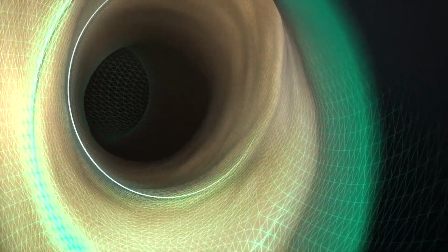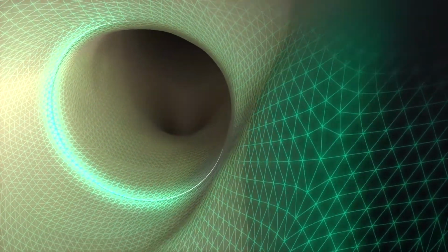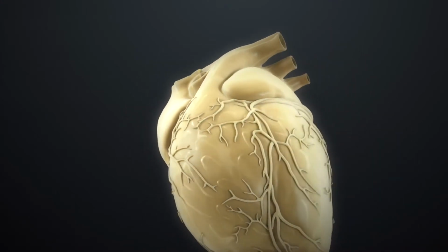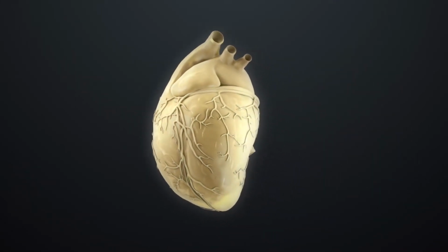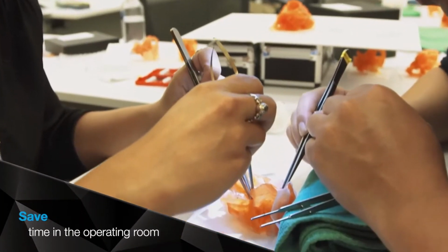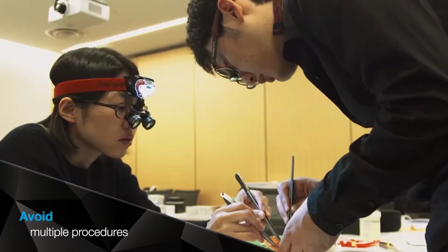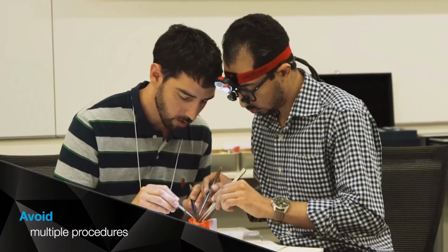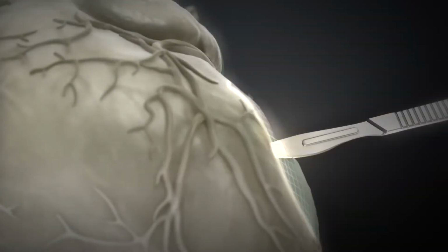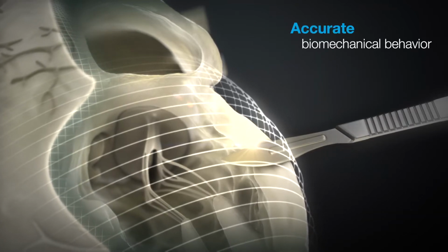3D printing technology, software, and materials combine to create models that replicate close to the same biomechanical properties as human tissue and bone, giving you the power to create the most lifelike anatomical models available. Academic medical centers, hospitals, and medical device companies can create realistic testing environments and train in settings that are as close as you can get to the real thing. Experience the most consistent, accurate representation of your targeted pathology while suturing, cutting, inserting, and deploying devices.